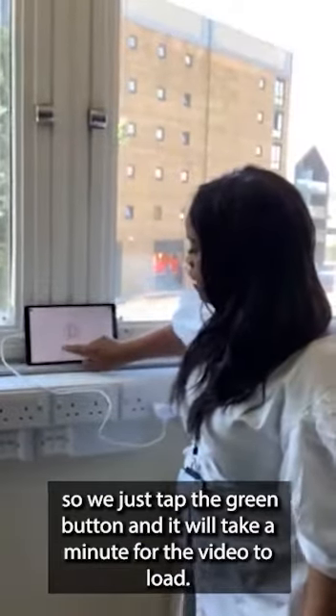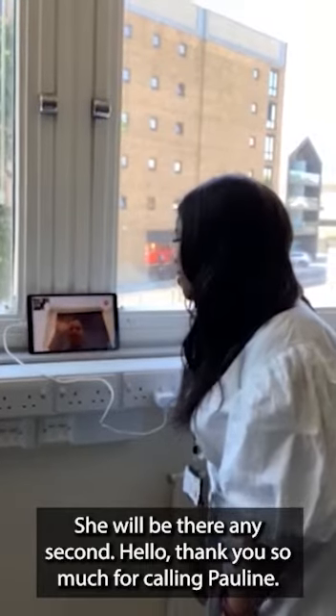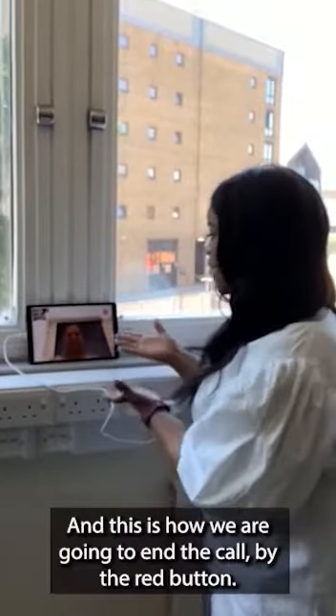You just tap the green button and it will take a minute for the video to load. She will be there any second. Hello — thank you so much for calling, Pauline. And this is how we end the call using the red button.